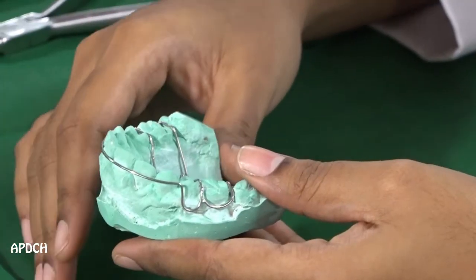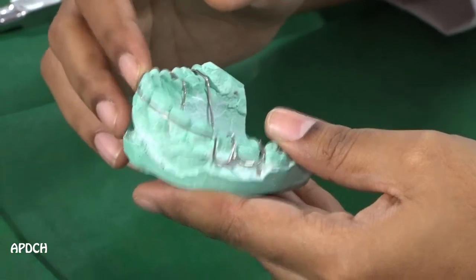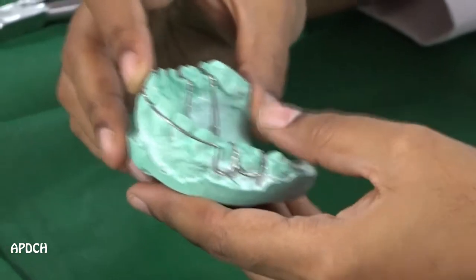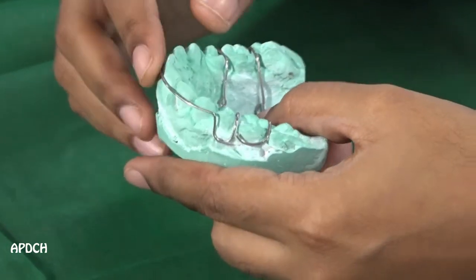It is a removable type of appliance, and in Hawley's appliance, it will maintain the tooth position exactly. With the help of wire components using stainless steel wire, the parts of Hawley's appliance are a retentive component which is a clasp, and an active component that is a labial bow. This labial bow can be either short or long.